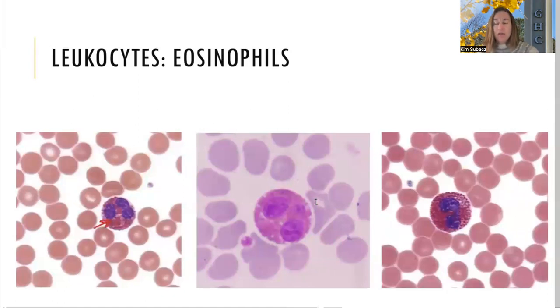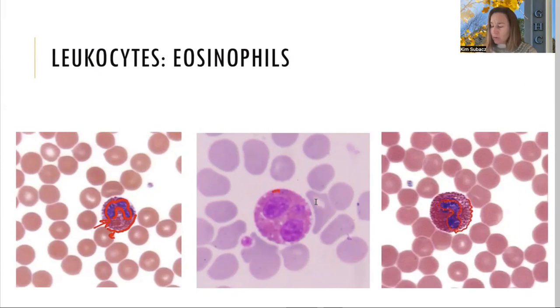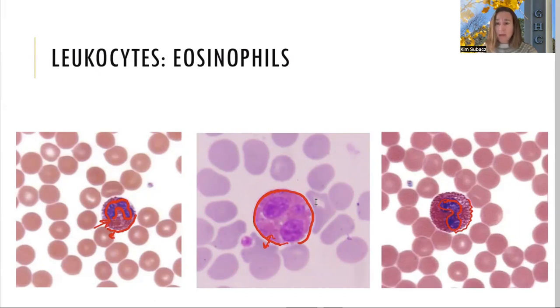Next are eosinophils. Their giveaway is the red coloration on their granules — their granules soak up the eosin dye in the stain, giving them a reddish color. On a slide this looks similar to red blood cell color, with beautiful red granules contrasting against a purple nucleus. Even on older slides with faded staining, the reddish color remains distinguishable.